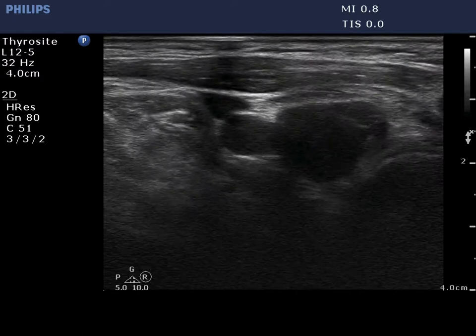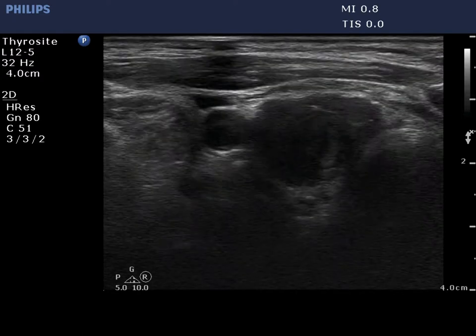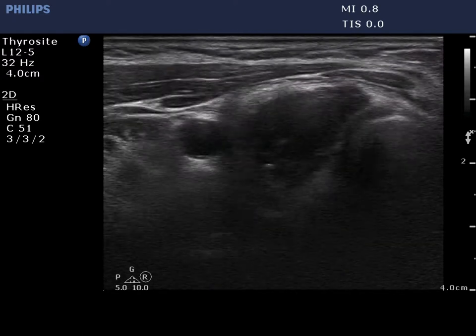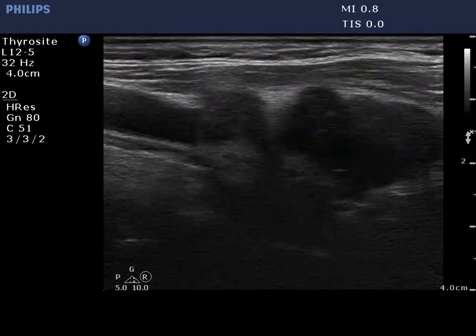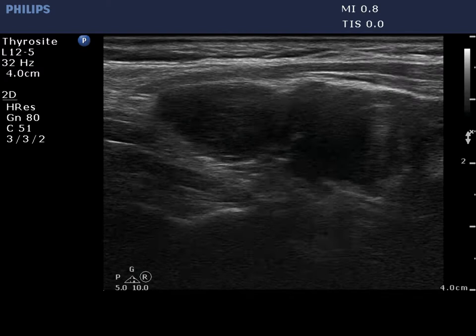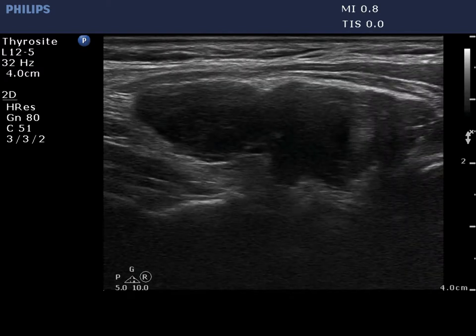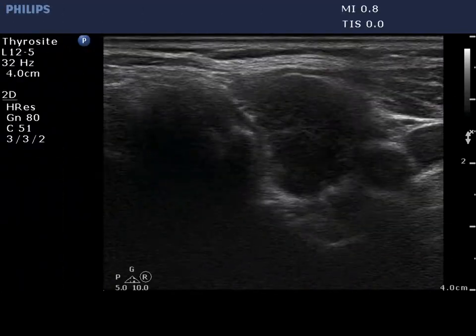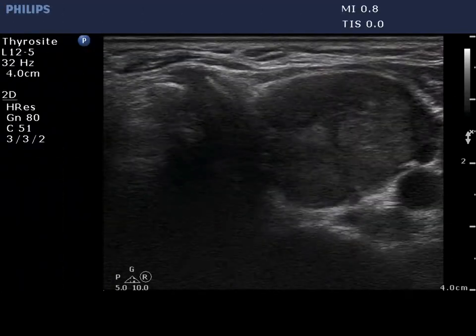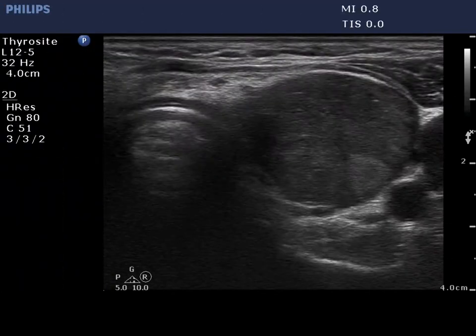The shape of the thyroid is irregular. The lobe is basically composed of a central large hypoechogenic part surrounded with an echonormal thin rim. The left lobe has a similar appearance.